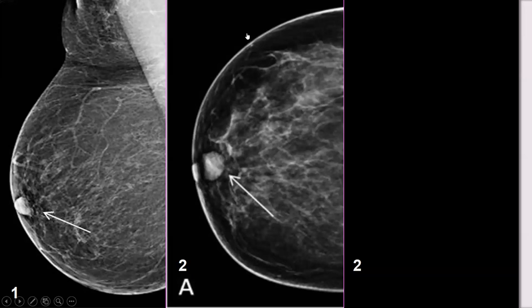Samia, what about this one? This is also most probably a nipple, inverted. Did you hear what we described in the first case? This is at the expected location of the nipple, surrounded by lucency. Yes, expected location, surrounded by lucency.